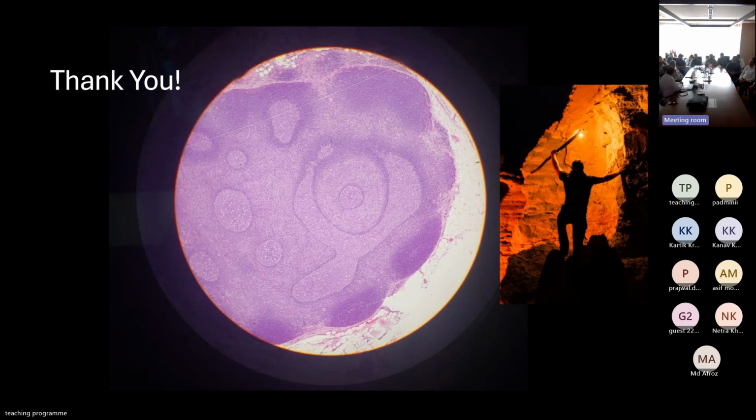Is there any role of immunocytochemistry, or is it not done? Yes, sir. Immunocytochemistry is done on the smear. From the paraffin block, you can cut 25, 30, 50 slides, but smears are limited, 7 to 8. And all the immunohistochemical markers don't work very well on the cytological smears. So we might get a bit of background staining, and it also has a very limited role.